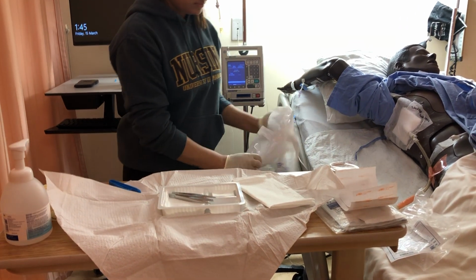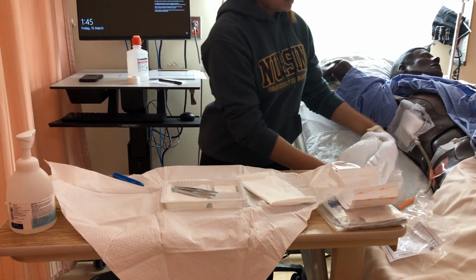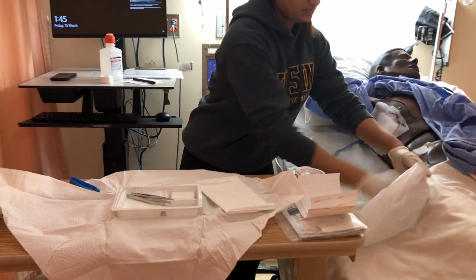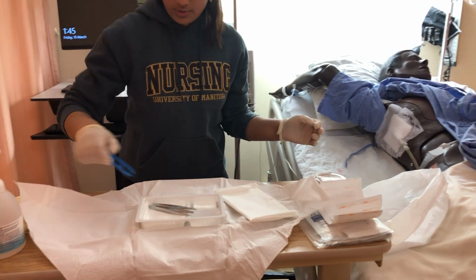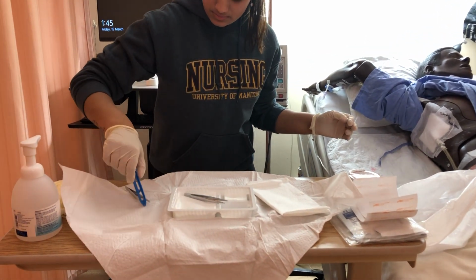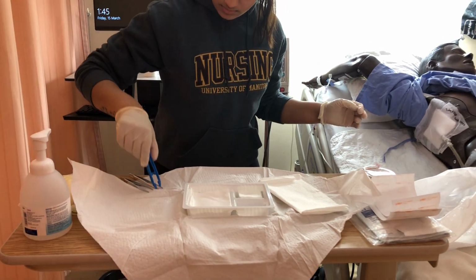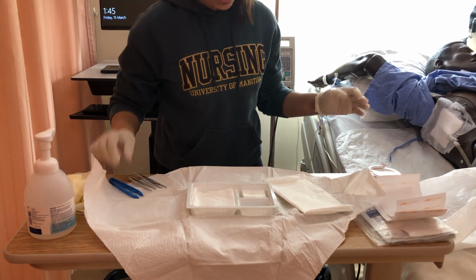When I put those back in there, this is not sterile. So I would restart this whole thing, but to put some time into the demo, I'm not going to do that. So I'm going to now move my forceps to this side, out. These are the side, those are in. Now I'm going to pour my normal saline.